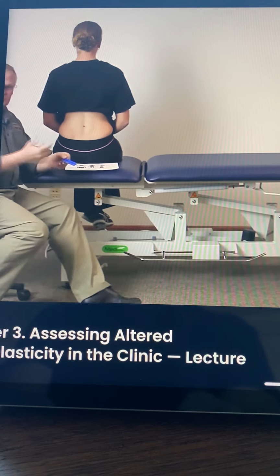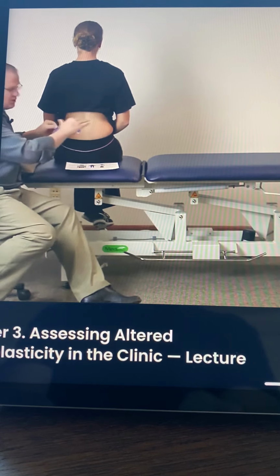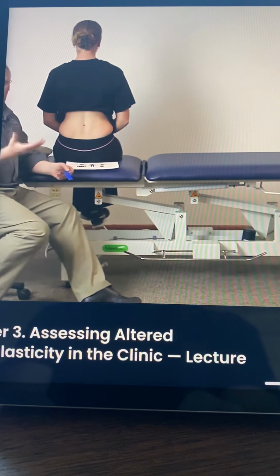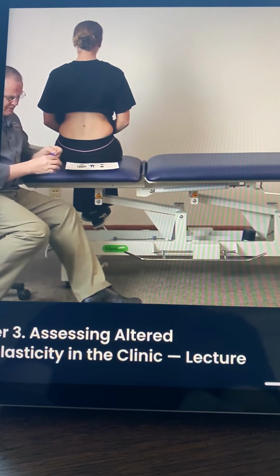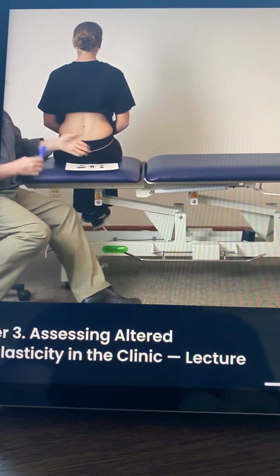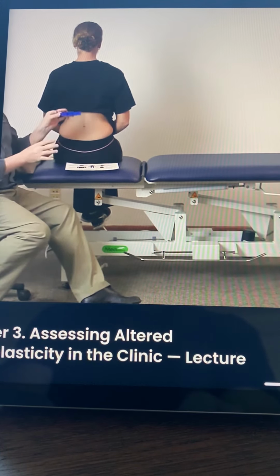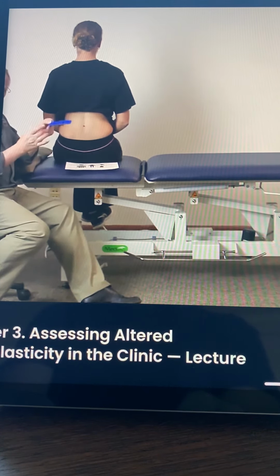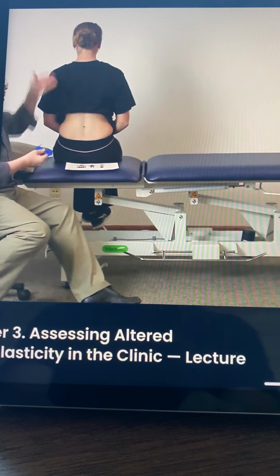We have a couple of options. We can take the caliper and start at 0 and work our way slowly out. The problem is it will take quite a bit of time. That's what's so nice about the normative values. In this case, we're going to take the little sliding scale and move it to about 5.5 centimeters, which is our normative value. And we will start here. Depending on Heather's reply, we will then move the calipers closer or further apart to establish what's normal in her case.